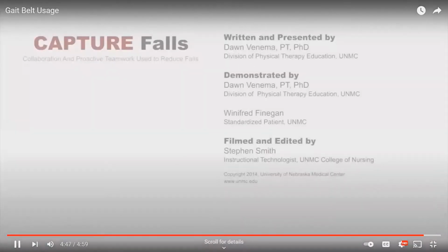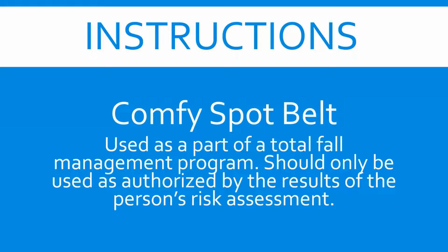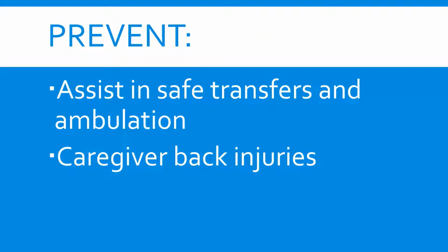At the ARC of Cape May County, we use the Comfy Spot belt. This is used as part of a total fall management program. This should only be used as authorized by the results of a person's risk assessment. The gait belt is used to assist in safe transfers and ambulation for a person. It is also used to help prevent injuries to you.